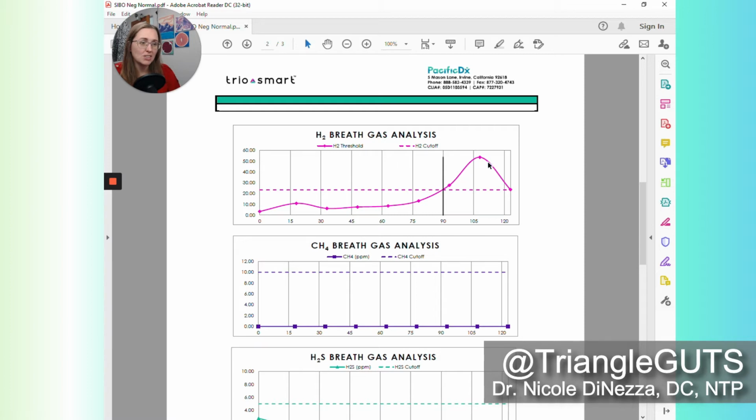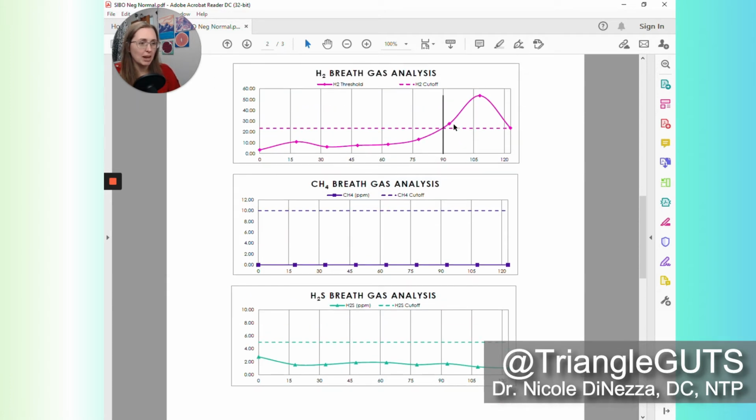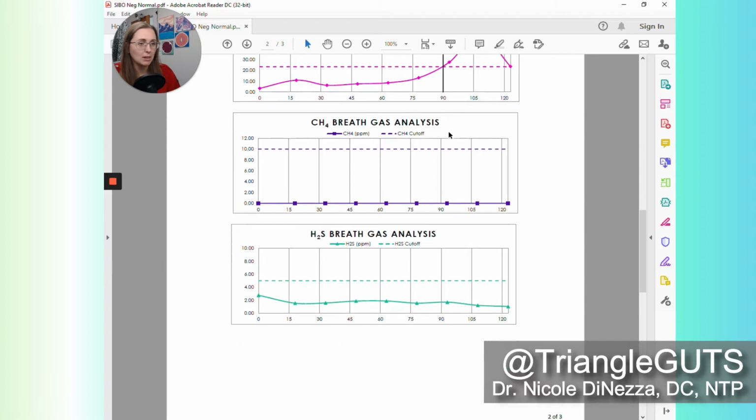And then you can see a nice clear hump when that sugar solution gets to the colon, and that is normal colonic fermentation. So the 90-minute mark is where most labs are going to do a cutoff. There is research that suggests that the cutoff for lactulose specifically needs to be more like 60 minutes rather than 90 minutes. And that's why, in my opinion, this one would not classify as SIBO. And I told my patient that. But you could see a nice hump when it gets to the colon, which we would expect with lactulose.